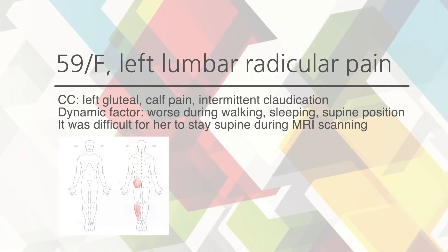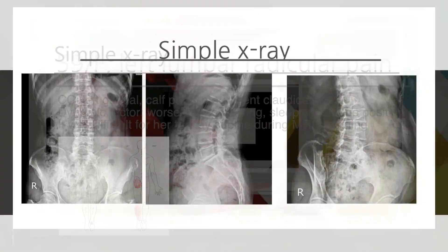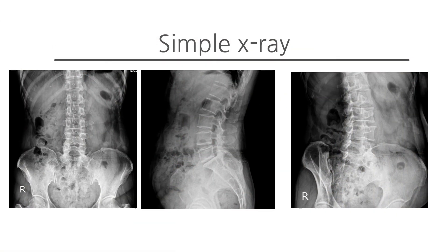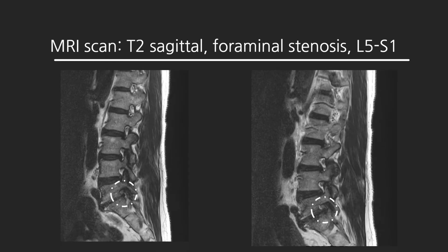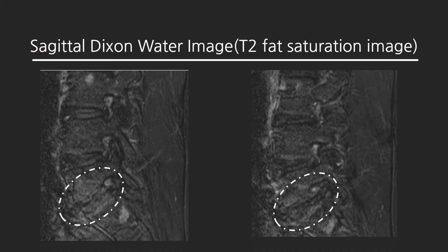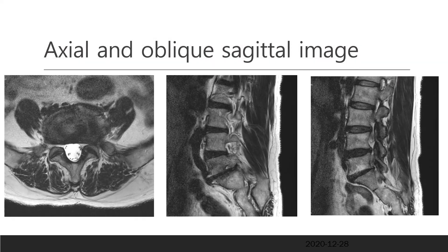Let's go to the practice. She has left lumbar radicular pain. She had to bear severe pain during the MRI scan because the spine position worsened her pain. Her simple X-ray tells disc narrowing at L5-S1. The oblique image makes me anticipate a complicated procedure because the high iliac crest obscures the safe triangle and creates a narrow window. T2-weighted image shows foraminal stenosis at left L5-S1. Fat saturation image shows high signal intensity of the endplate and disc space at L5-S1. Axial image shows left lateral protrusion of a black disc. The oblique sagittal image shows L5 dorsal root ganglion swelling and foraminal stenosis.